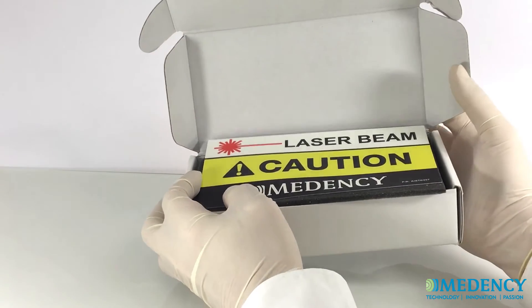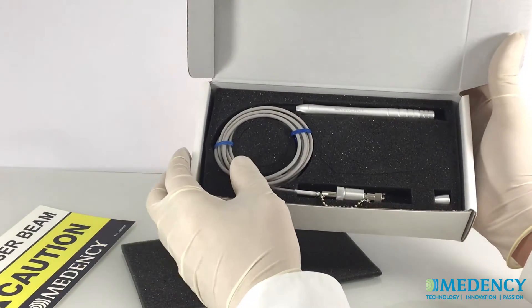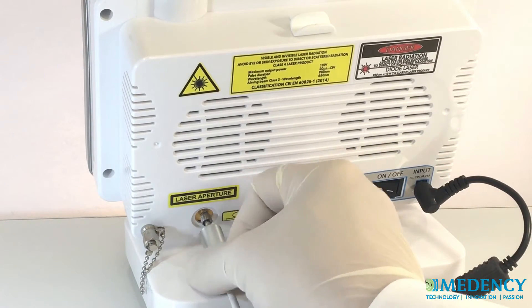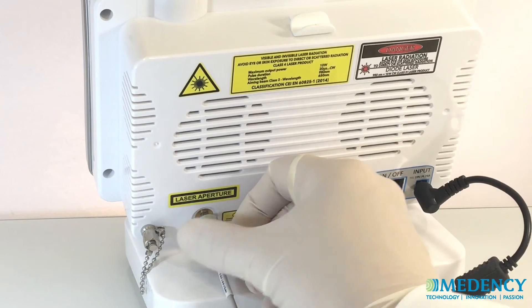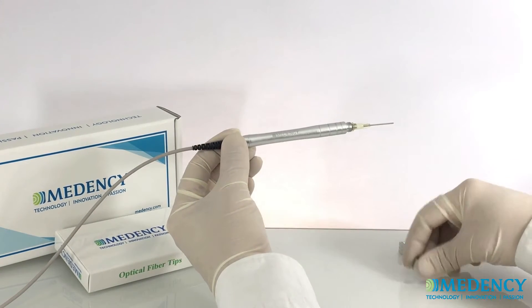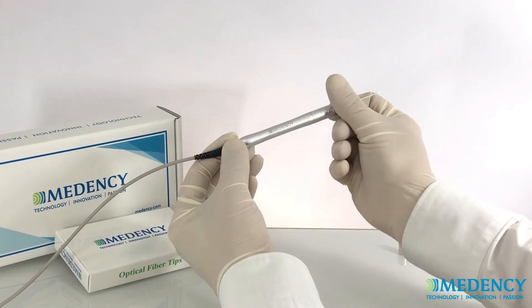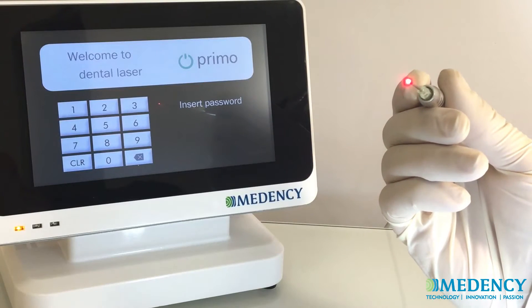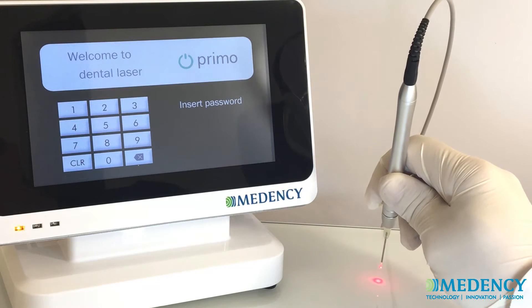Now it is time to connect the fiber optic delivery system to the laser. Insert the fiber optic assembly into the base of the laser unit. Remove the protective cap from the end of the handpiece. Carefully insert the selected tip followed by the cap with hole and tighten it until snug. To check if the tip is properly inserted, shine the aiming beam from a straight tip onto a surface and verify that the red aiming beam makes a pattern of a circle.